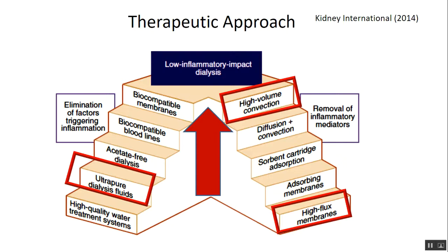The advantage of HDF and HDX is that they can remove inflammatory markers and mediators in patients with sepsis.